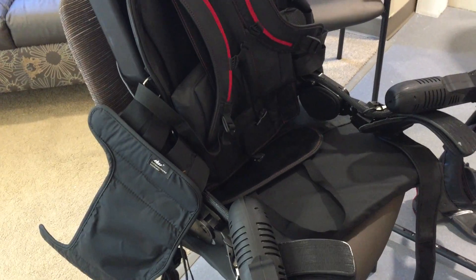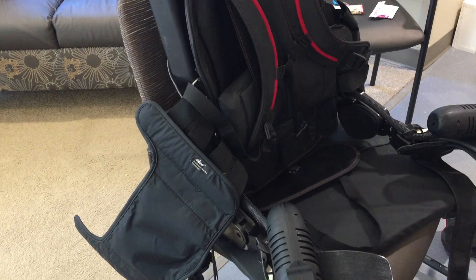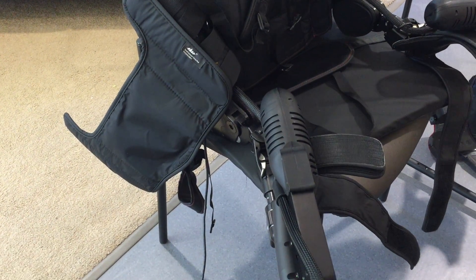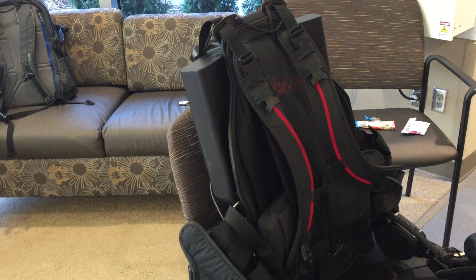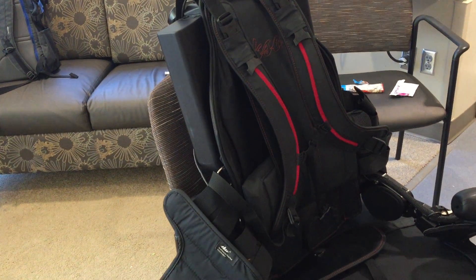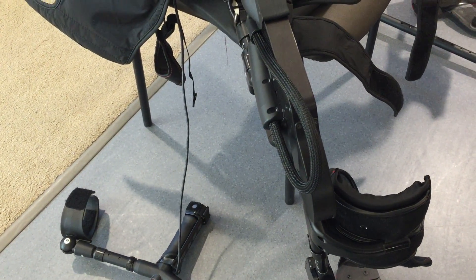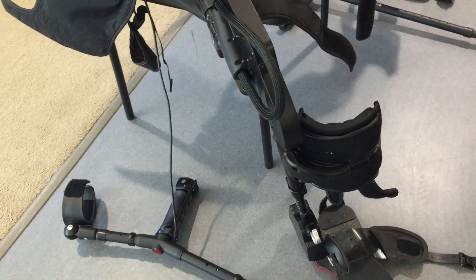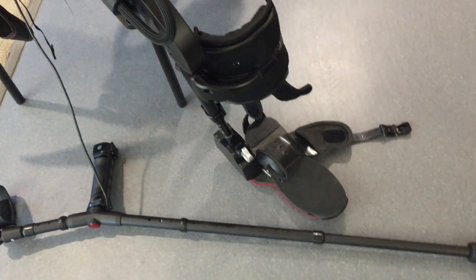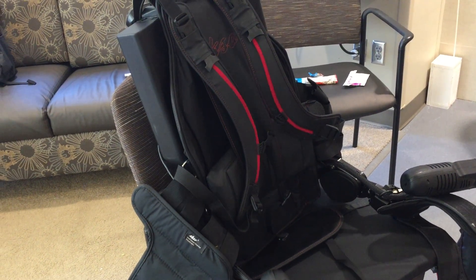The software is what makes this particular exoskeleton so intuitive. It provides whatever power the patient is able to contribute, and the exoskeleton then provides the remaining power to ensure that each step is completed effectively and efficiently. It can be adapted and changed on the fly, allowing a variable amount of assist for patients — it's a pretty dynamic tool.